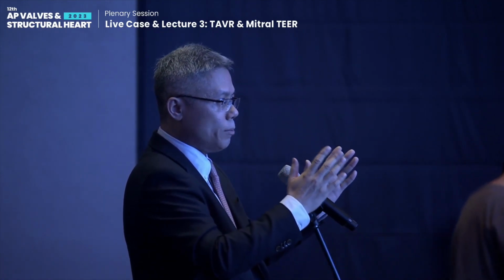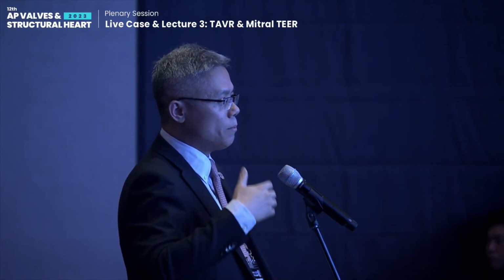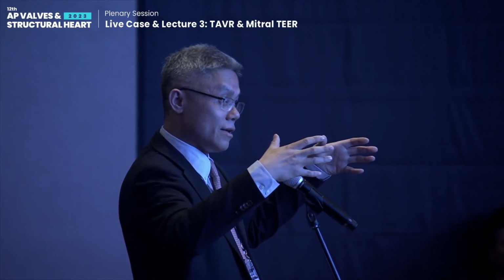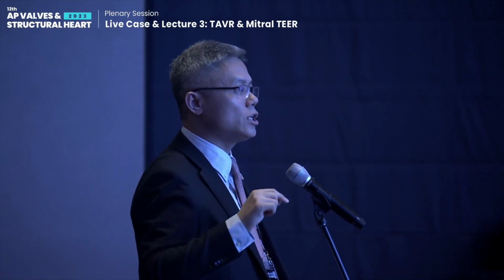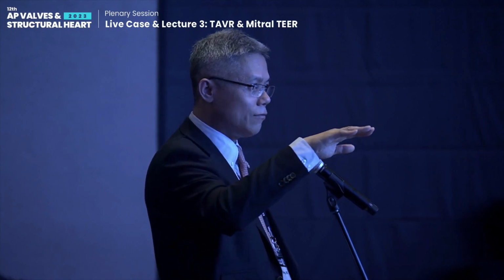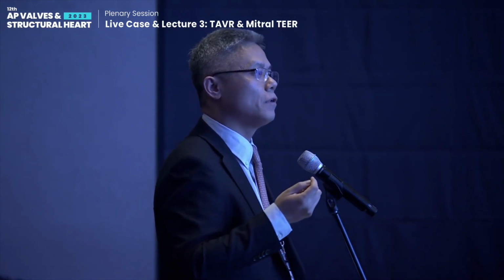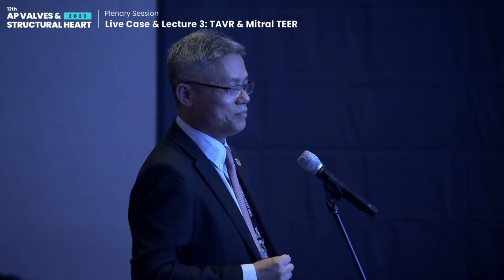This kind of anatomy will be suitable for VitaFlow. Beyond this, if the case has an ascending aorta diameter less than 38, it will be more comfortable. But only these two levels, the annulus level and the LVOT level, are enough for the anchoring zone for VitaFlow. That's my experience.